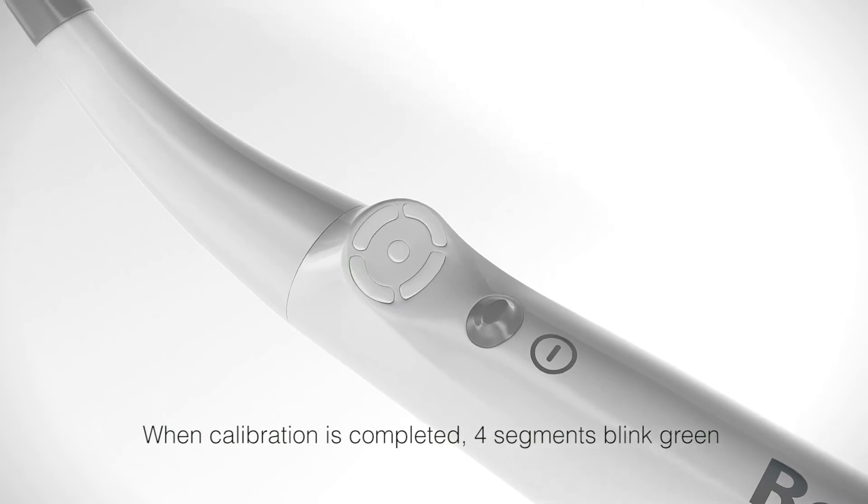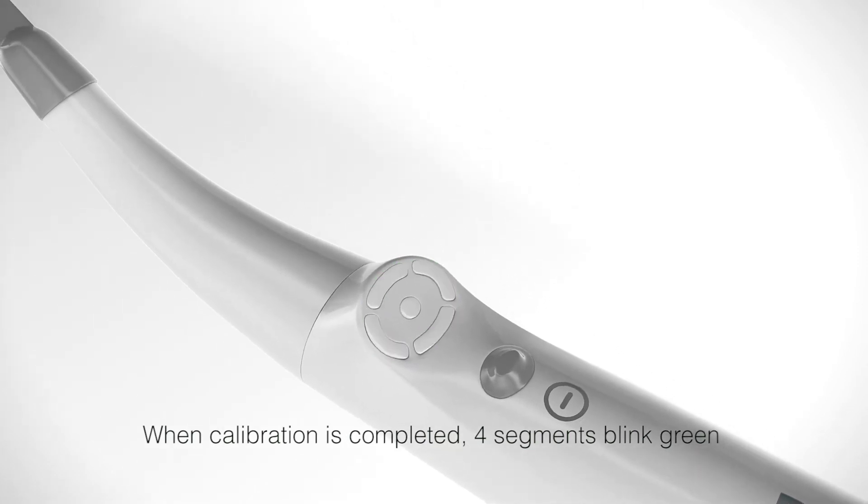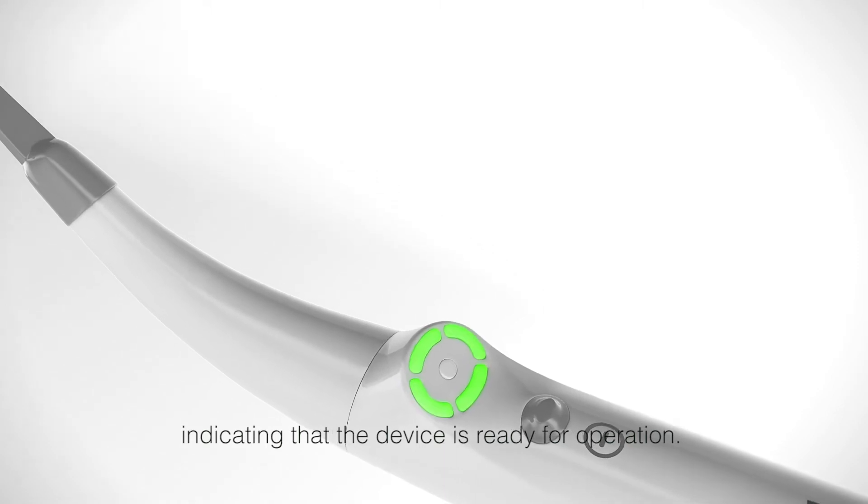When calibration is completed, four segments blink green indicating that the device is ready for operation.